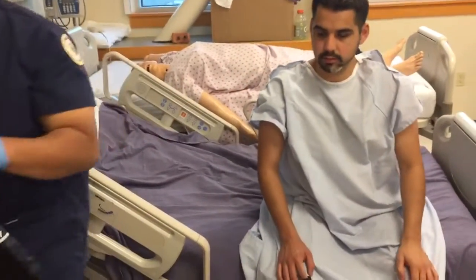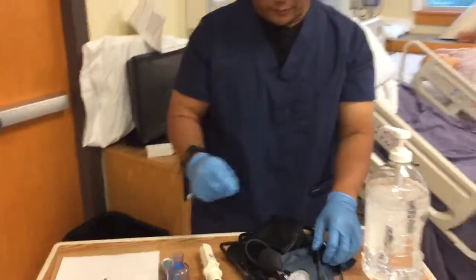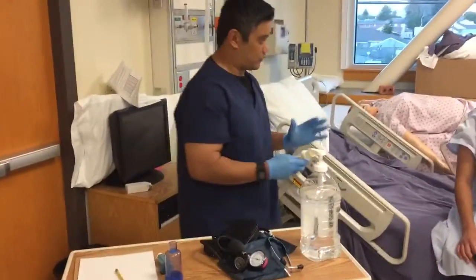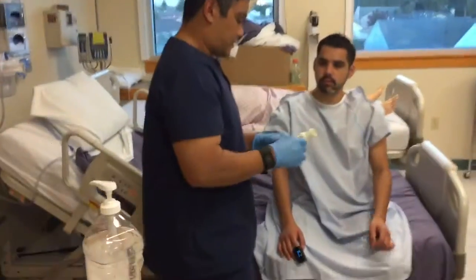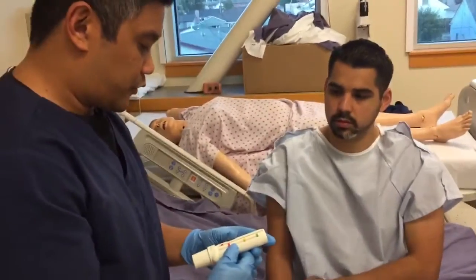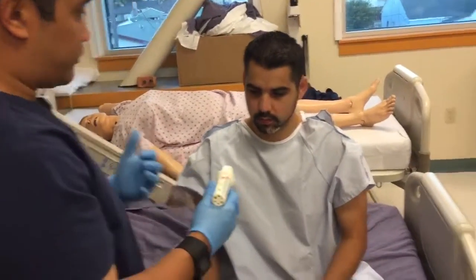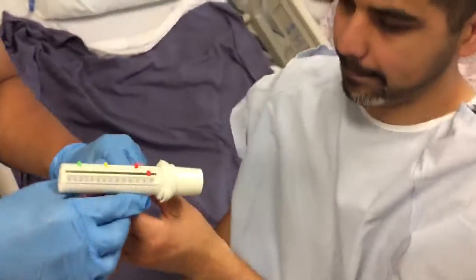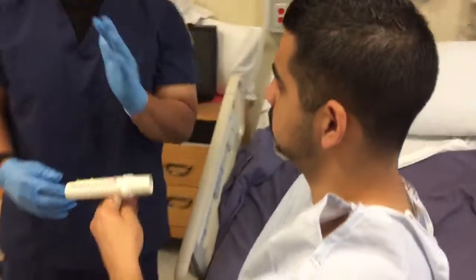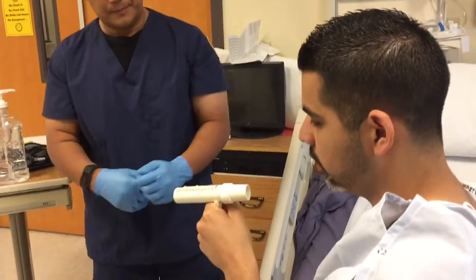Thank you, Christian. And before I forget, we also have to do a peak flow meter, and this just measures your expiratory rate. I look at your chart, and then we set it up for your age and height. So if you don't mind, just holding on to this one, and go ahead and take a deep breath in, and push out, exhale as much as you can. Really hard. Okay.